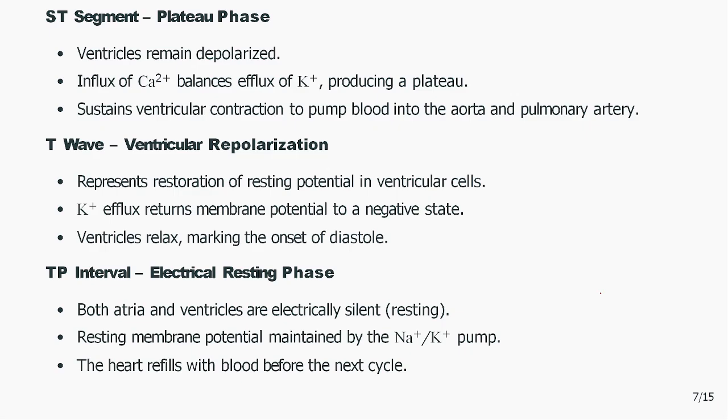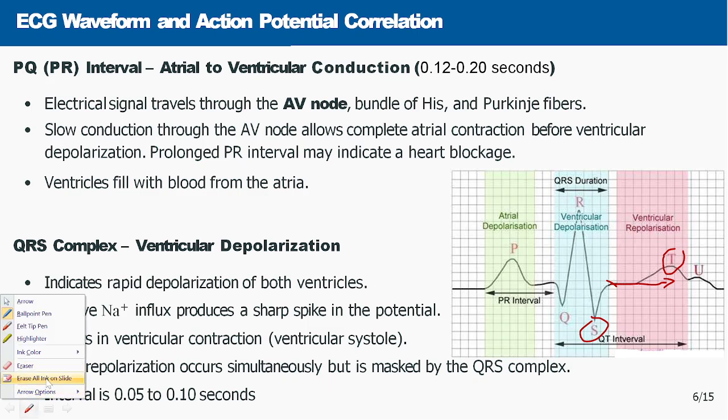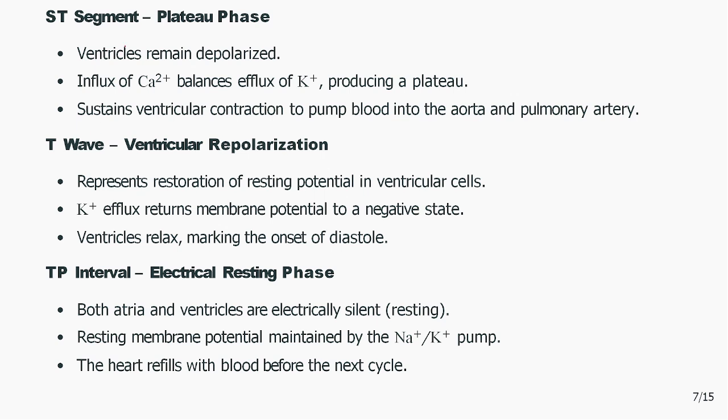The next is the ST segment, that is your plateau phase. Ventricle remains depolarized. In this phase, S to T, you mark in this curve from S to T, there will be no much higher peak in this region. We call that plateau phase.